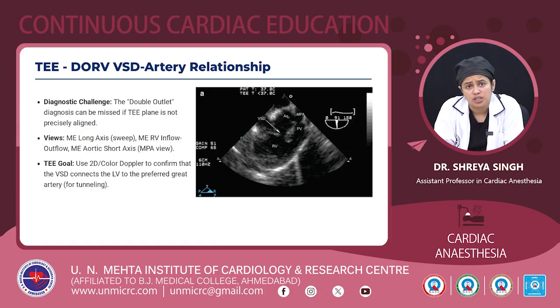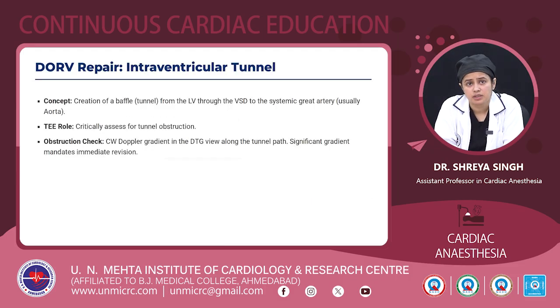So the diagnostic challenge for us is that the double outlet can be missed if the TEE plane is not precisely aligned. The views commonly used are the mid-esophageal long axis, RV inflow-outflow, and the aortic valve short axis views. And we can use 2D or color Doppler to confirm that the VSD connects the LV to the preferred great artery for tunneling. Usually an intraventricular tunnel is formed for this repair.